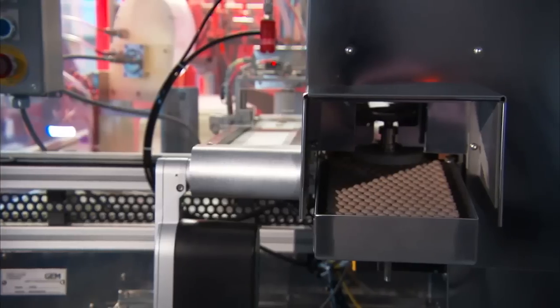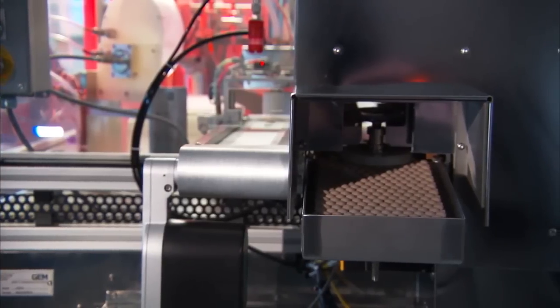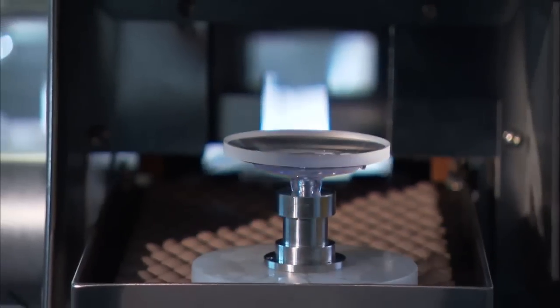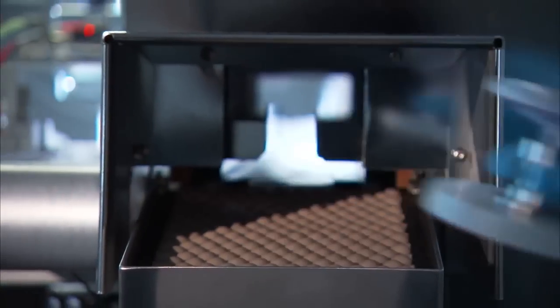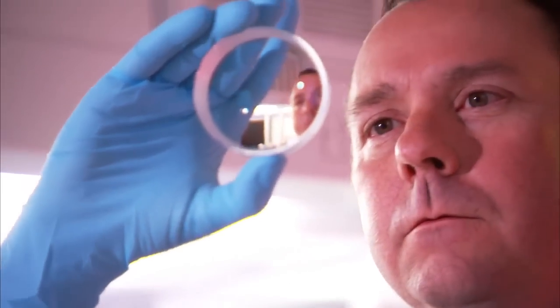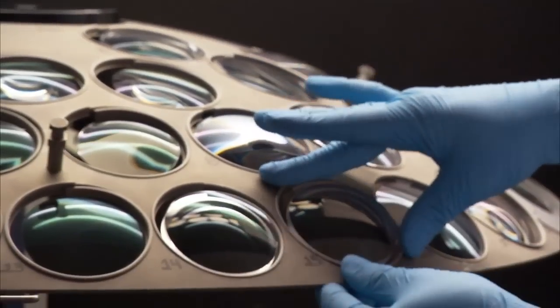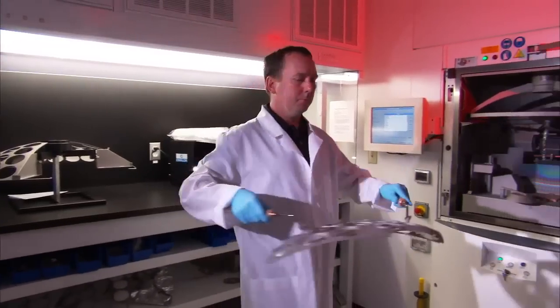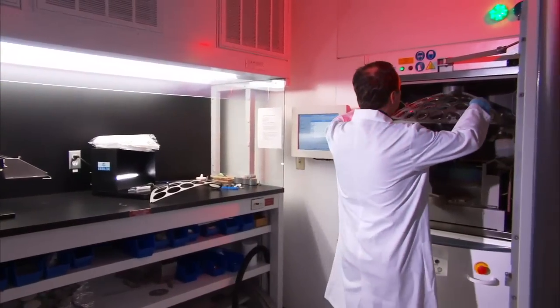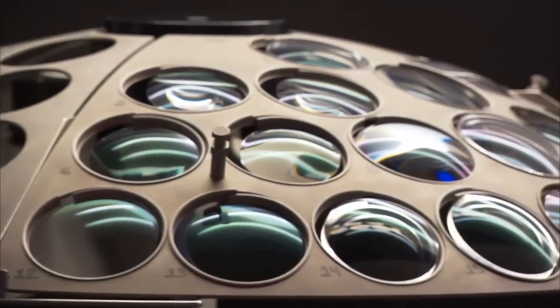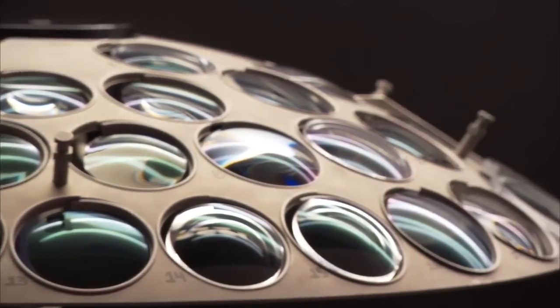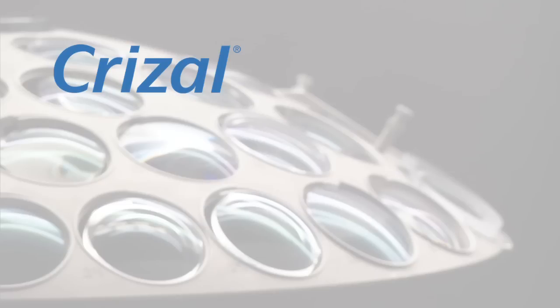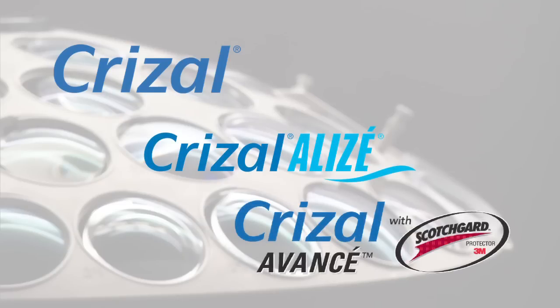Emerging from the curing chamber approximately 9 minutes later, the lens is ready to have the AR layers applied. After a visual inspection, the hard-coated lenses are loaded into the computer-controlled vacuum chamber for the remaining steps of the process. Our Crizal facility's advanced vacuum coating system produces Crizal, Crizal Alize, and Crizal Avance with Scotchgard protector lenses.